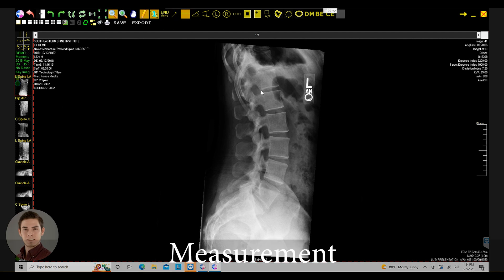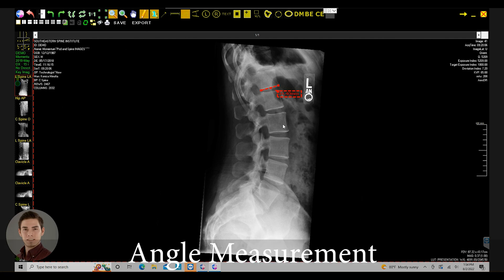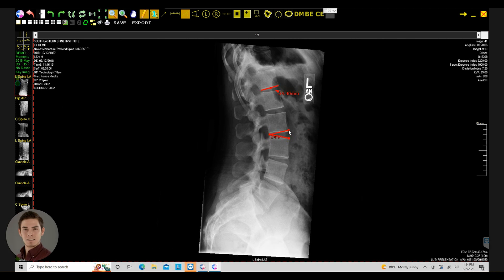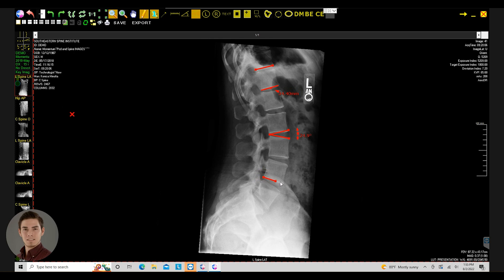Moving on to the measurement tool: click the first time to set the first position, a second time for the second position, and that gives you your annotation which you can move afterwards. For the angle measurement tool, your first click is the corner of the angle, the second click is the first opening, and the third is the second opening, then you can set the positioning of the annotation. With the Cobb angle tool, set the first line by clicking twice, then set the second by clicking twice, and finally place the annotation wherever you'd like.